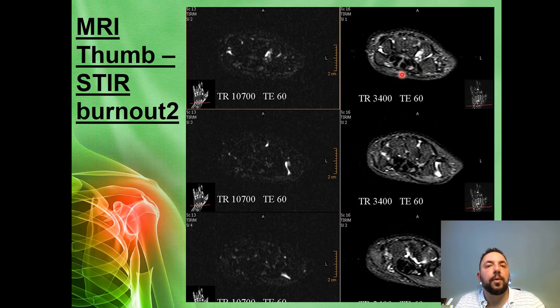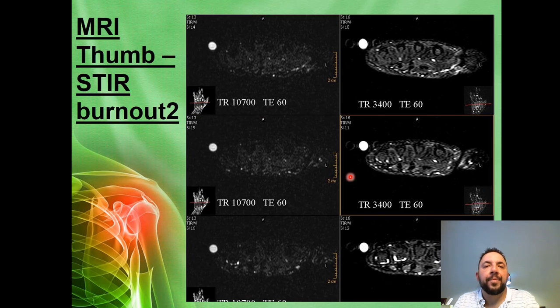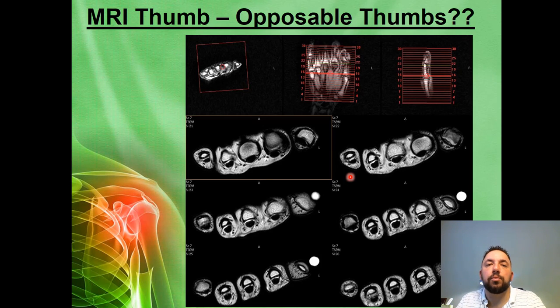Again, that TR burnout, as I was telling you about before, the TR of 10,000, right? All the slices that we add in a small body part, we simply go from this TR of 10,000 and one package, one acquisition, one concatenation, just to talk about all vendors. We go to possibly 3 of them now. And now with 3 packages, 3 acquisitions, 3 concatenations, I have a smaller field of view and I broke down the slices into groupings so that I have a shorter TR and I didn't have burnout of signal. So keep in mind with STIR sequences, you don't want to have a TR that's really too long that you lose all the signal. That's the only thing that's different between these 2 acquisitions. So be very careful with an extensive TR that's too long.